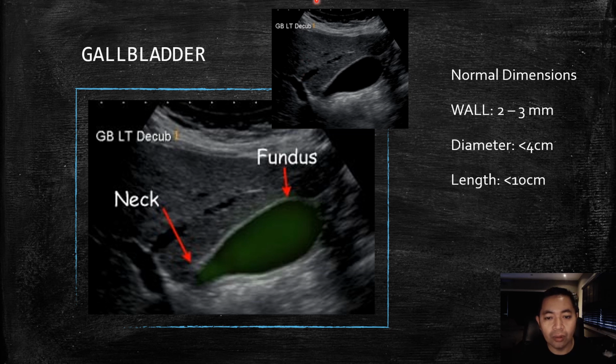Note that the gallbladder wall in contact with the liver bed appears to be thinner, and the gallbladder walls in contact with the duodenum and other viscera appear thick. This is due to acoustic enhancement from the fluid-filled gallbladder lumen. In addition, the duodenal wall, which is in contact with the gallbladder, can make clear discernment of the gallbladder wall difficult. Hence, in a lot of patients, the wall of the gallbladder in contact with the liver bed is used for wall measurement, the anterior wall right here.